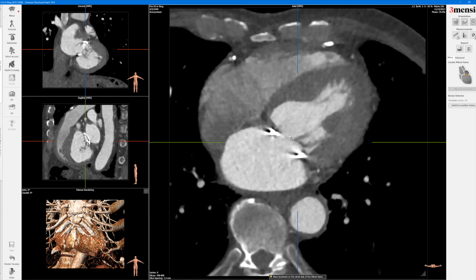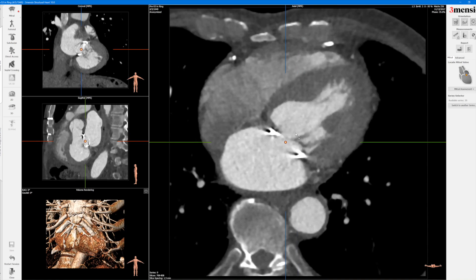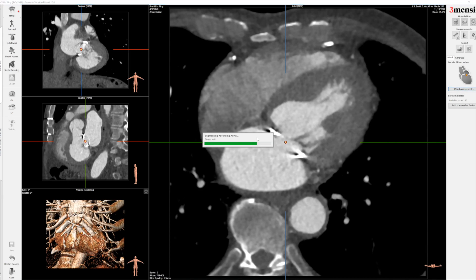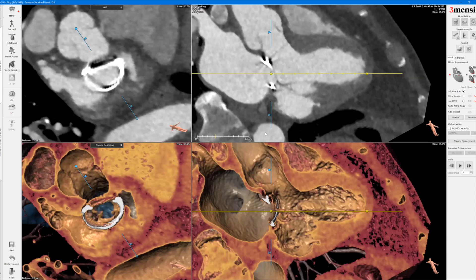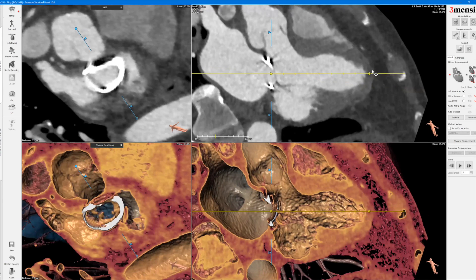Here you can see the annuloplasty ring located at the mitral annulus. You first place a dot across the mitral valve and click the mitral assessment, so that on the next screen the axis needs to be positioned right across at the LV apex, and then you proceed to measure the annuloplasty.